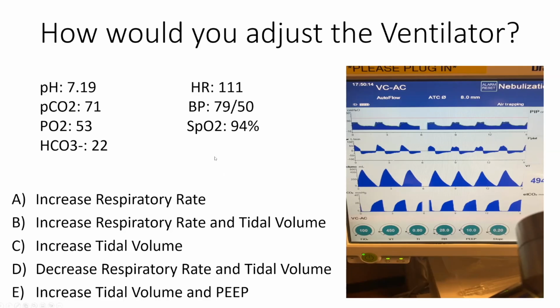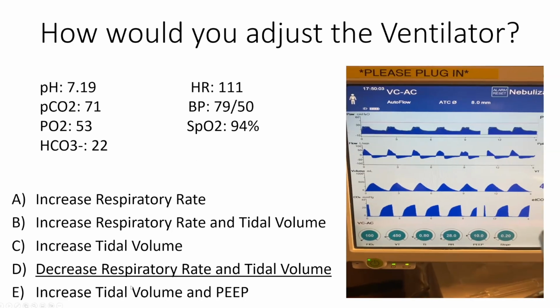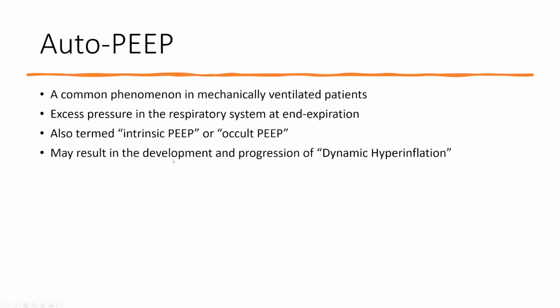So the best way to manipulate the ventilator in this situation would probably be to decrease the respiratory rate and the tidal volume. And the reason for that has everything to do with AutoPEEP. So what exactly is AutoPEEP?